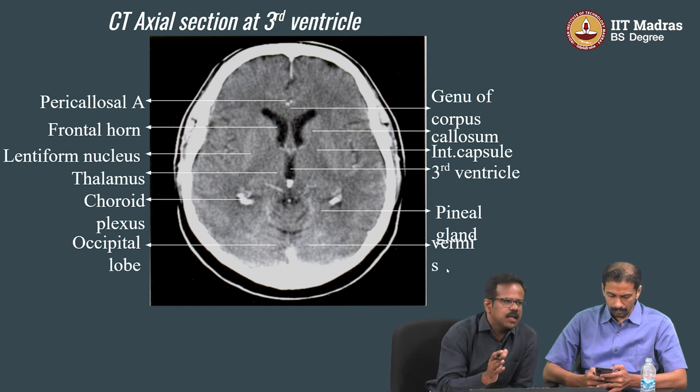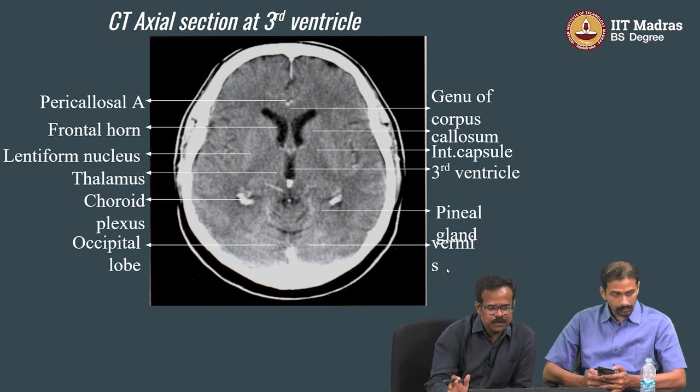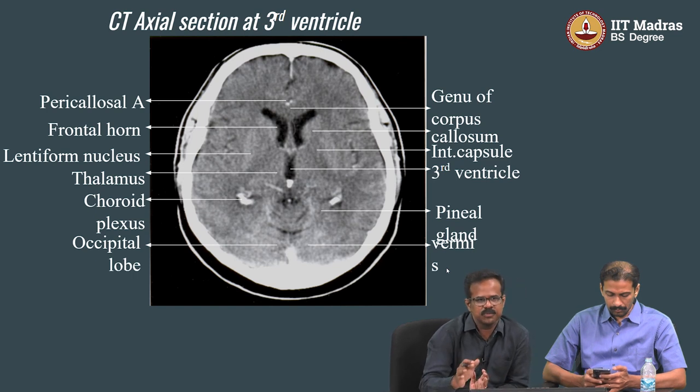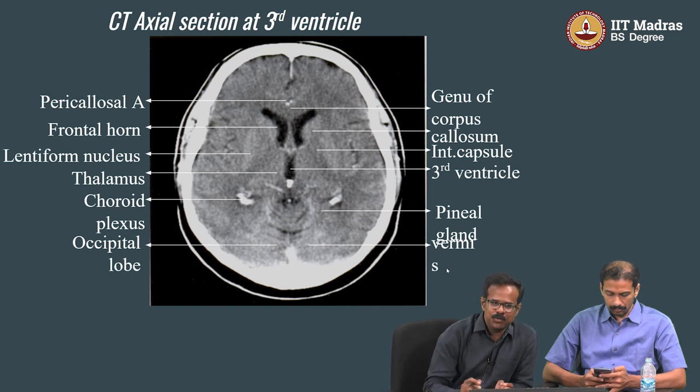This is the topic title. You saw how the radiologists interpret an image, right? We are trained in this. But if you train an algorithm, it also has to remember these things, and there are specific ways of annotating. Every time a data scientist comes to us, the first request will be to give ground truth. I cannot give the ground truth in my own way. There is a standardized format. There are a lot of software solutions for annotation also.